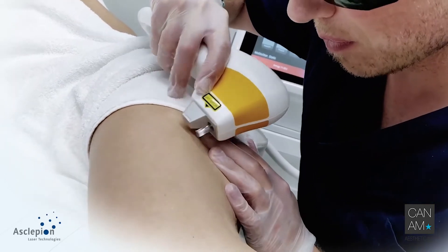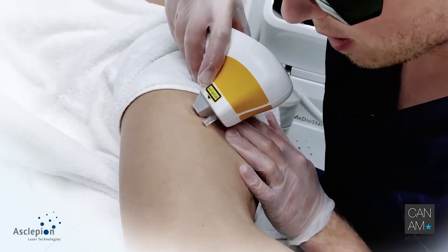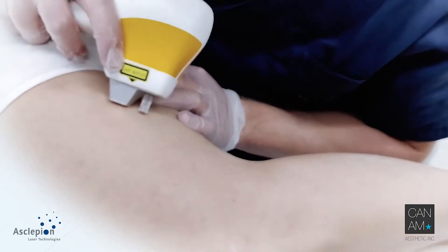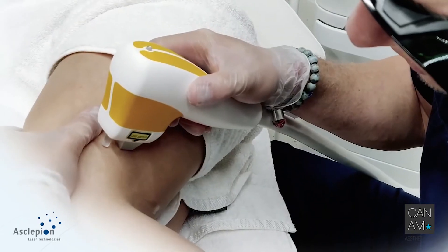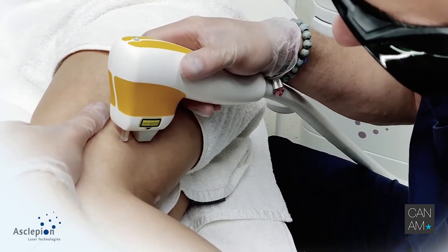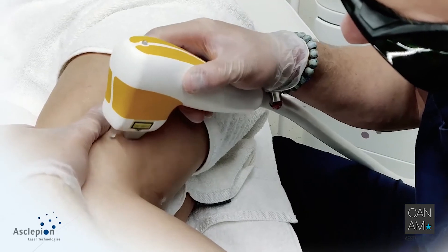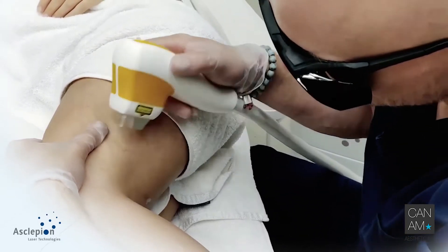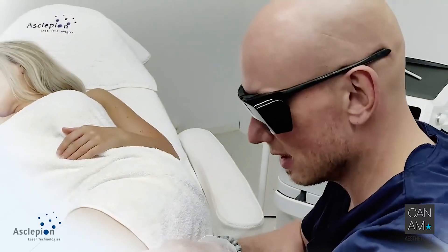Three, two, one. Three, two, one. Three, two, one. It might be a little bit painful. Three, two, one. Here we go — shot. Next one. Here we go — shot. This was 90 degrees in this vessel. Then we go ahead.